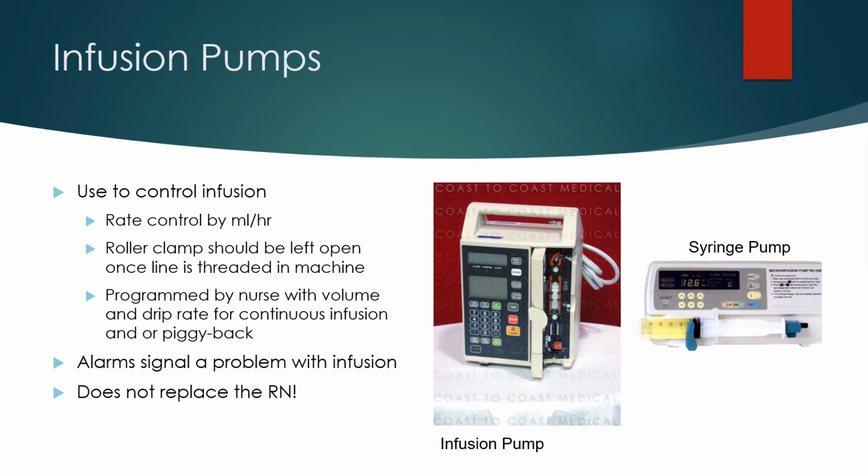When we're considering running a large volume of medication, those large bags running the infusion continuously, we put it through the pump. We have referred to the pump throughout this lecture, and here's how we can look at those pumps a lot closer. Why do we use a pump? It just helps control the infusion. If you work in the emergency department, you may run fluids by gravity, especially if those patients that come in have lost a lot of fluid volume and they need those fluids quickly. But most nurses that work on the floor will utilize a pump to help control the rate of the infusion.